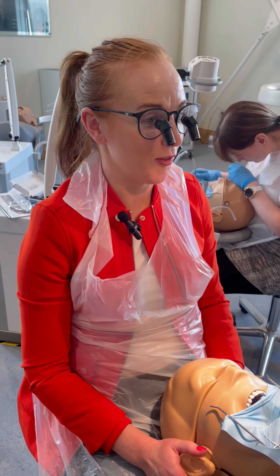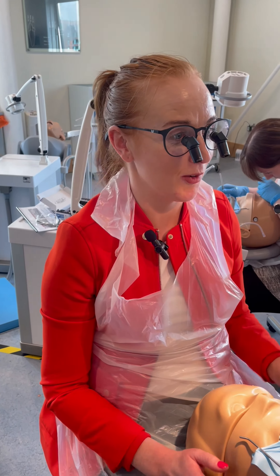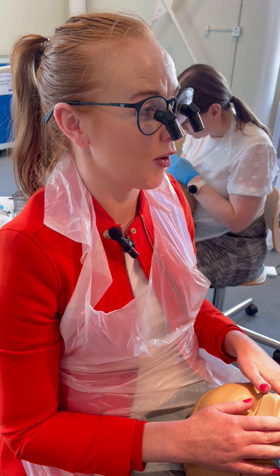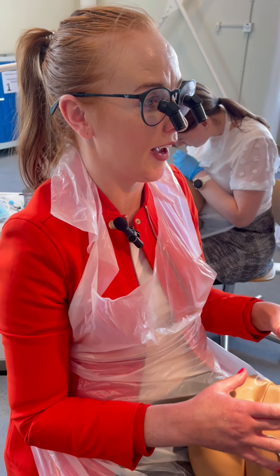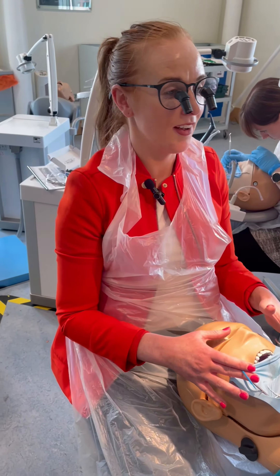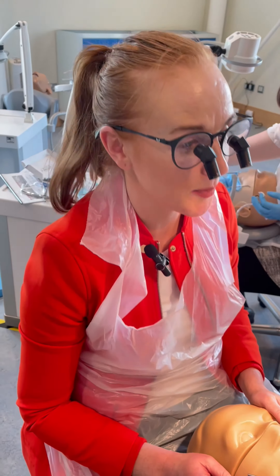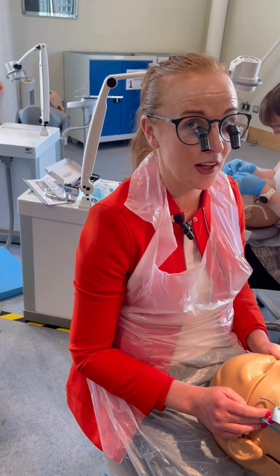How are you finding the loops? Getting on really well — I've never worn loops before so these are very strange, but I can actually see quite a lot even though they're very magnified, without feeling like I can't see enough. So I'm actually finding them really well. My back feels really good too, because I'm normally upside down — so yeah, really good.